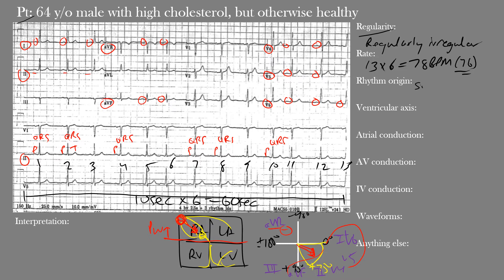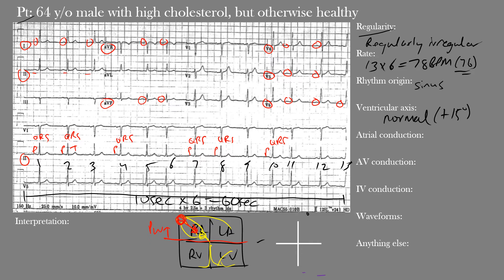So the rhythm is originating from the sinus node — this is a sinus rhythm. Now how about the ventricular or QRS axis? You should have gotten a normal QRS axis; the actual axis here was positive 15 degrees, which is normal. We say 'ventricular' because we're looking at the QRS complex, and you may also hear it called the QRS axis. The reference points are: 0 degrees, +90 degrees, ±180 degrees, and -90 degrees.